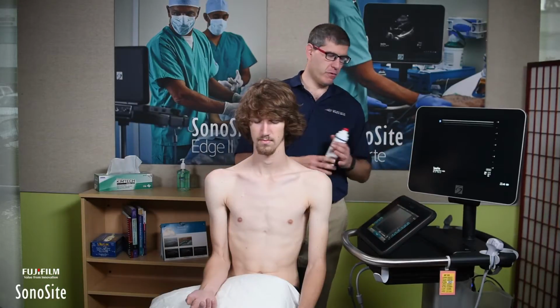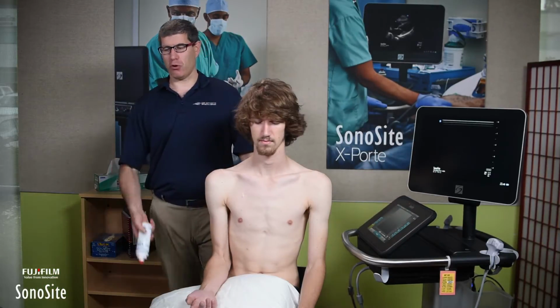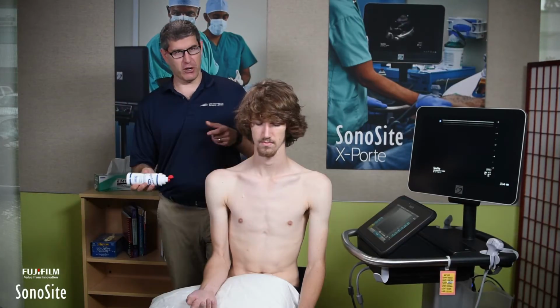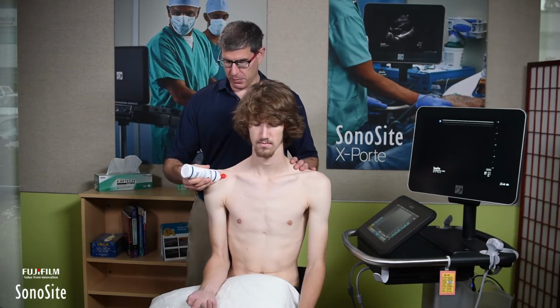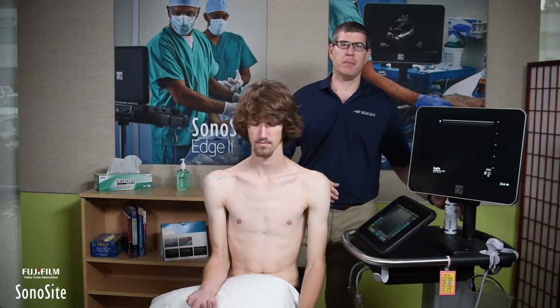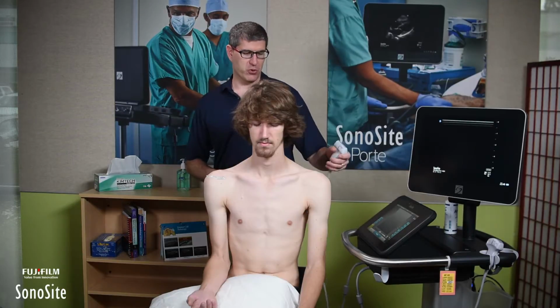Before I go into the wonders of a dynamic scan, I'm just going to show how you would quickly do an overview scan. So first thing I'm going to do is get some gel. A little pearl is if you rotate it and give it a little thump, that will help get the gel into the right spot. And I'm going to be putting the gel onto the patient for the bicep scan, which is going to be the first part of the shoulder scan I'm going to do.